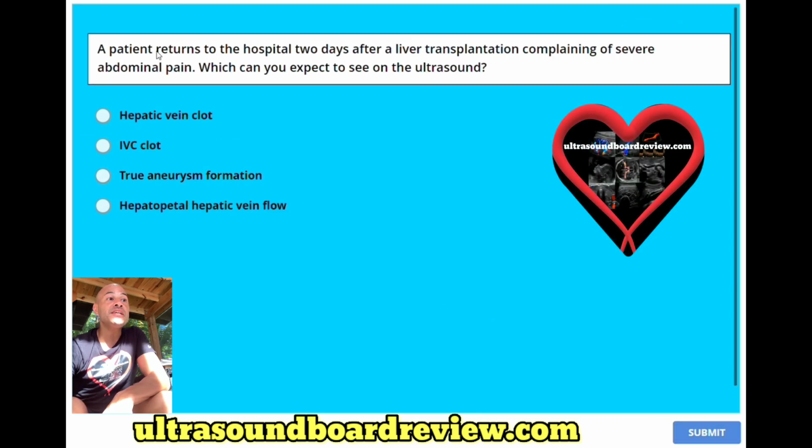Question number 13. A patient returns to the hospital 2 days after a liver transplantation complaining of severe abdominal pain. What can you expect to see on the ultrasound? A, hepatic vein clot, B, IVC clot, C, true aneurysm formation, or D, hepatopedal hepatic vein flow? The answer is B, IVC clot.